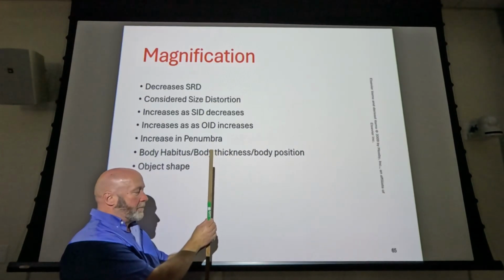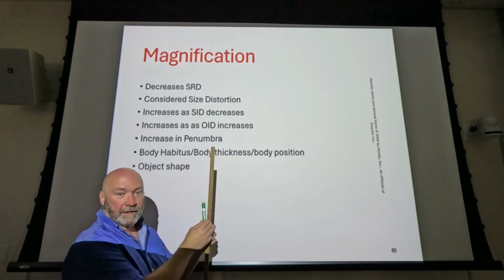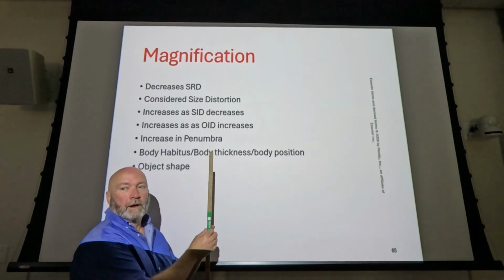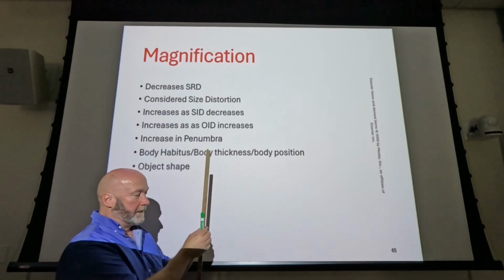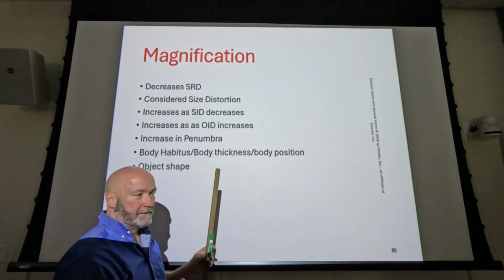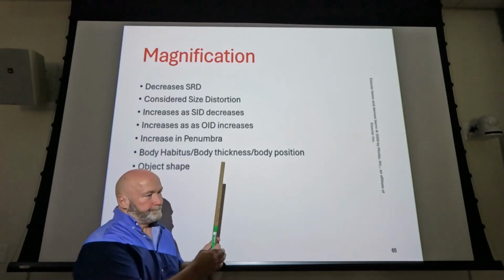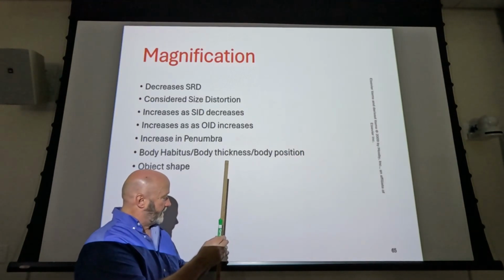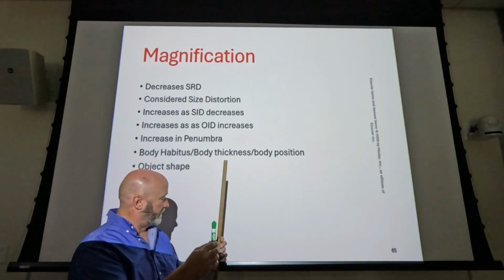I've not ever done this before, so I don't know how this is going to work out. But let's say you've got the spine, but what's directly in front of the spine? Okay, in the upper end, you got the esophagus. Let's think a little bit lower down, let's say into the abdomen. Two great big vessels. Yeah, you got descending abdominal aorta, and you've got the inferior vena cava. The vena cava is not really the issue here, but the abdominal aorta is. So abdominal aorta is just in front of it. For the most part, the liver is going to completely cover it up, right? Even on hypersthenic patients, it's going to completely cover it up.